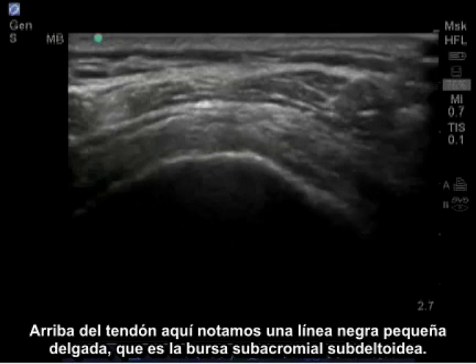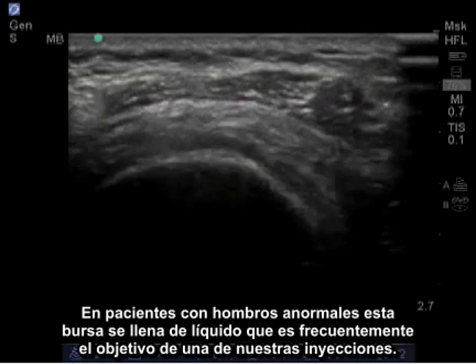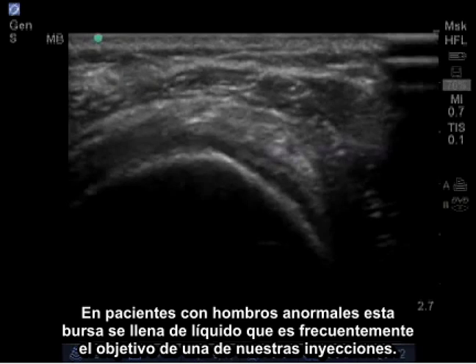On top of the tendon, we notice a little black thin line which is the subacromial sub-deltoid bursa. In patients with shoulder abnormalities, this bursa fills with fluid and is often the target of one of our injections.